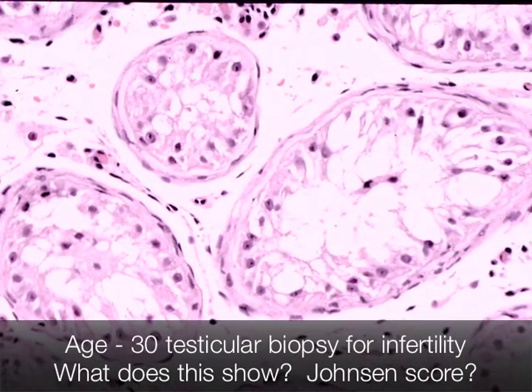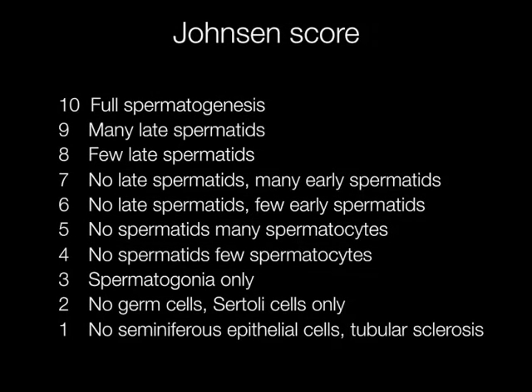This is Sertoli cell only. The Johnson score here is 2. The Johnson score is a continuum of appearances ranging from a score of 10, where there is full spermatogenesis, through to 1, where the seminiferous tubules are replaced by fibrous tissue with no epithelial cells. It is worth knowing what the Johnson score is and how to apply it, because clinicians may well request a Johnson score when sending testicular biopsies for assessment.